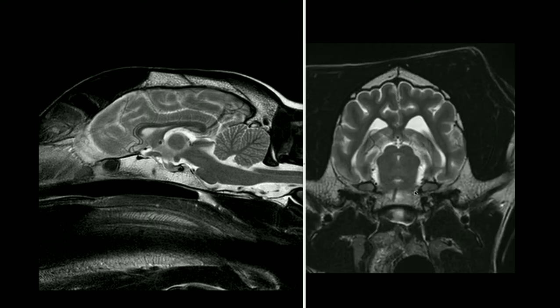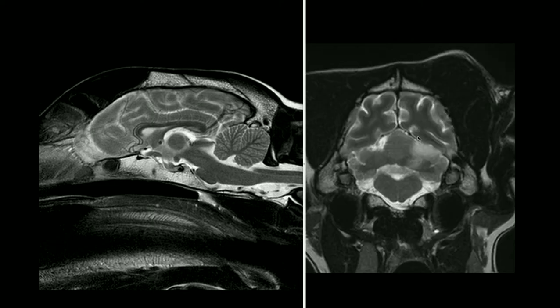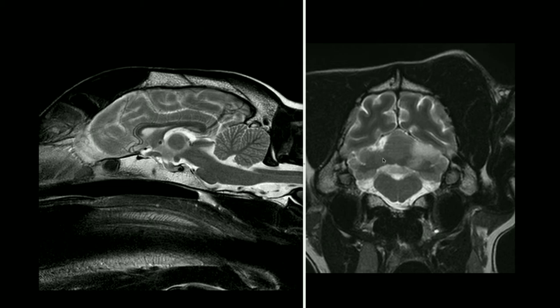Scrolling further caudally, we see a much larger, slightly more ill-defined lesion within the left cerebellar hemisphere — a large area of relatively homogeneous T2 hyperintensity. On the contralateral side there is a much smaller, more sharply marginated higher signal lesion in the right rostral cerebellum. Notably, these lesions — in the cerebellum bilaterally and the right thalamus — are essentially confined to grey matter, sparing the adjacent white matter.